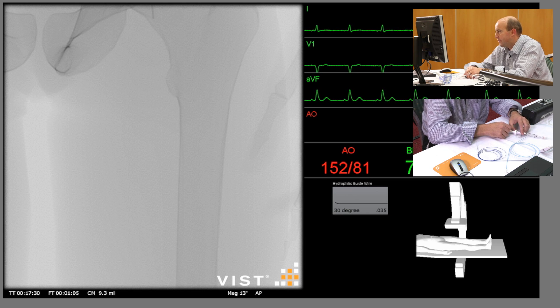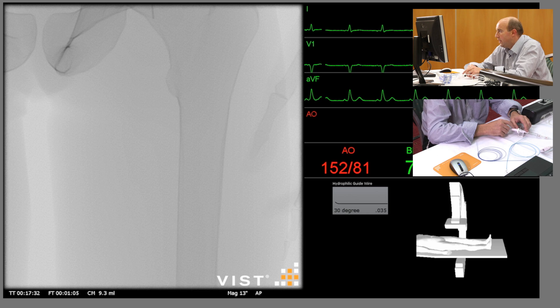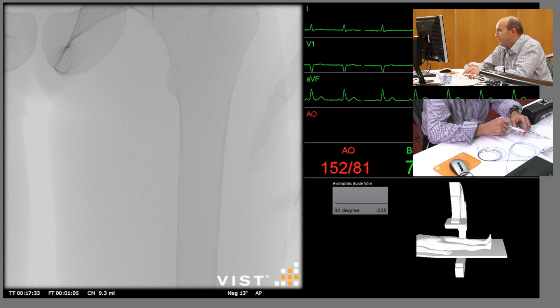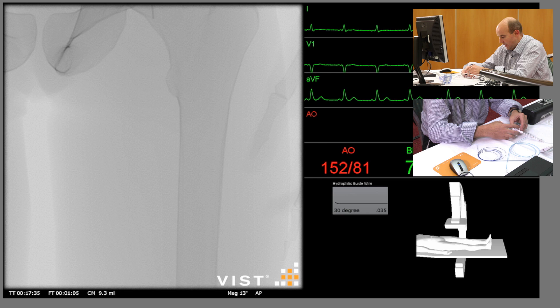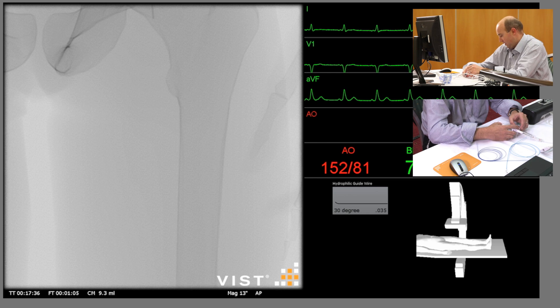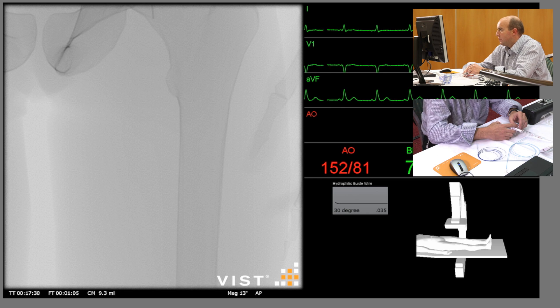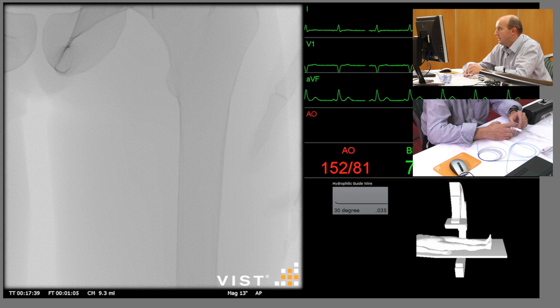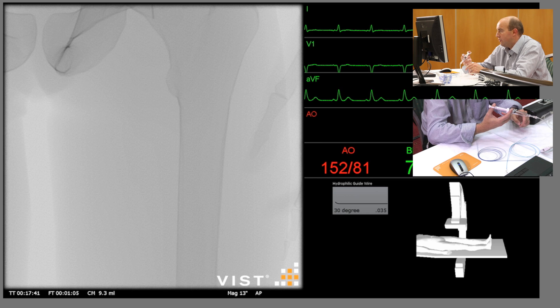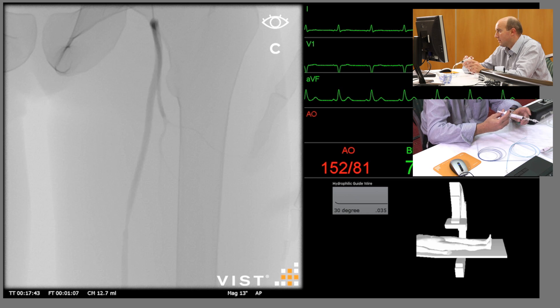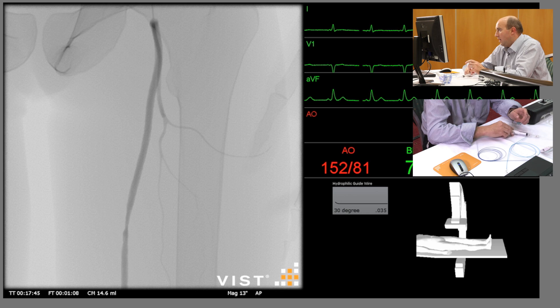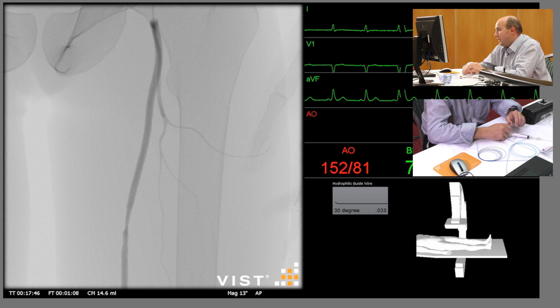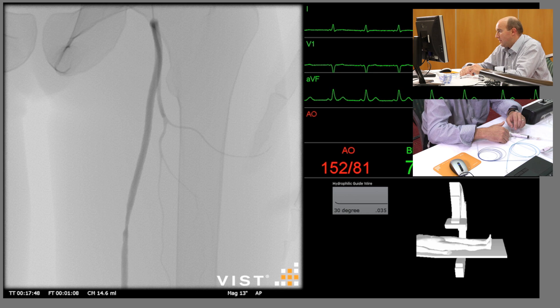What we'll do first is just a pure diagnostic run to confirm the SFA lesion. So if we press the right-hand pedal, which is a DSA run, and inject, you can see on the right-hand screen the SFA lesion is confirmed.